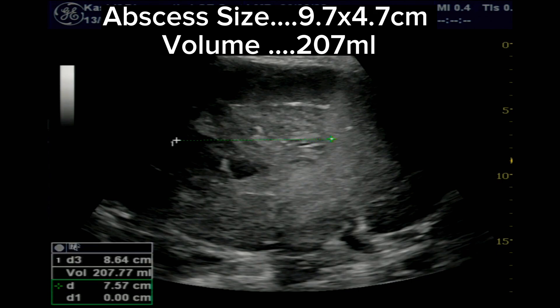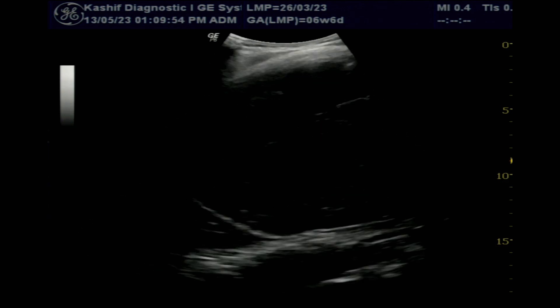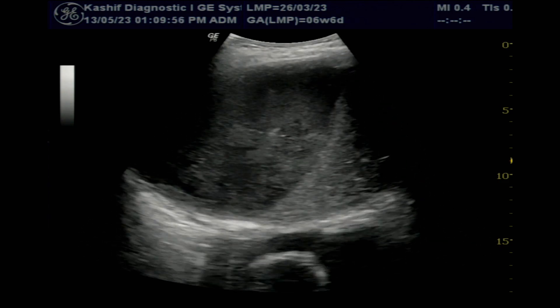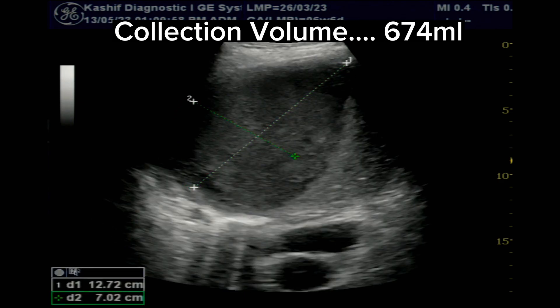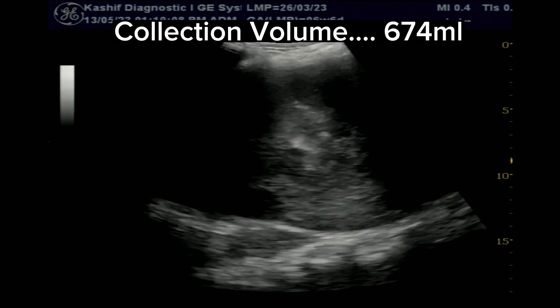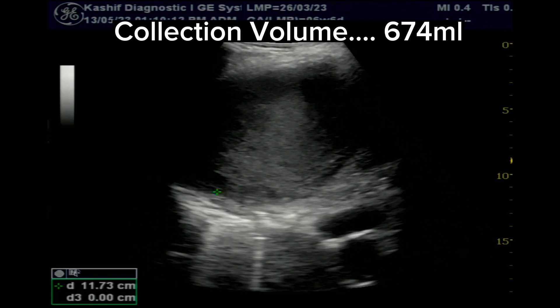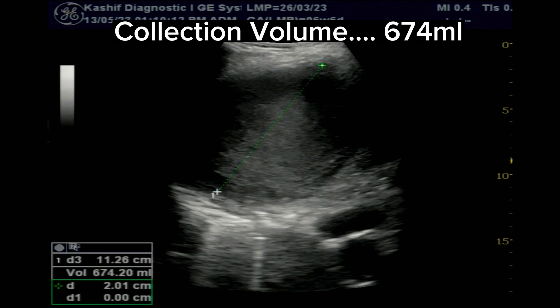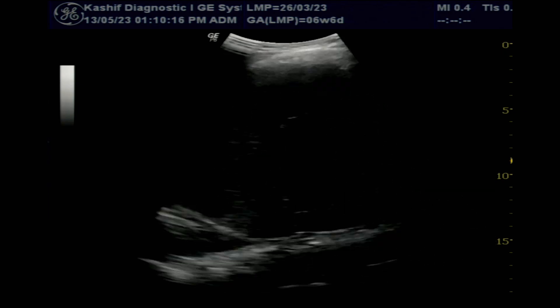It is now clear that this hyperechoic mass is the liver abscess, which has ruptured into the anterior subphrenic space. The large cystic mass is not within the liver — it is anterior and extrahepatic, with a thick collection of pus and fluid. The collection volume is 674 ml, which is a large collection. The abscess appears small and hyperechoic because it has ruptured.